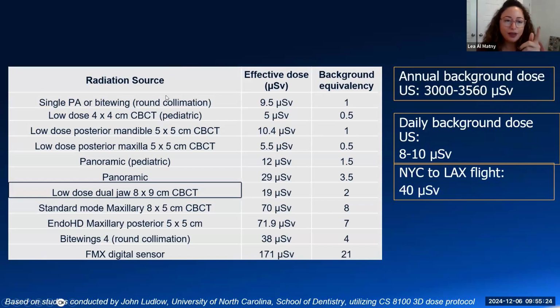So this is a table that was published by Dr. John Ludlow. He is an oral maxillofacial radiologist. He has been a faculty at the University of North Carolina. I think he retired last year. I'm not even sure if he's half retired, but we worked very closely with him, and those are numbers published by him independently.